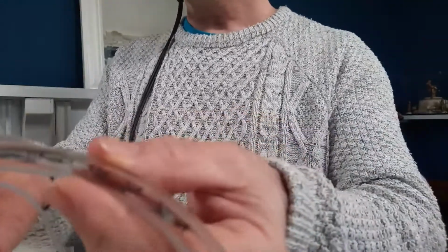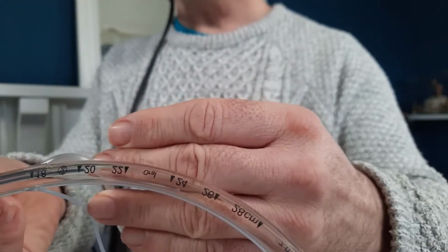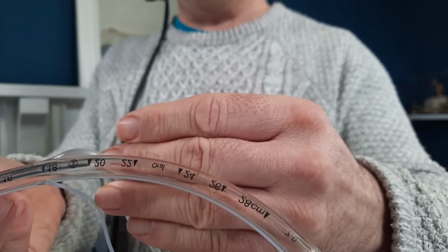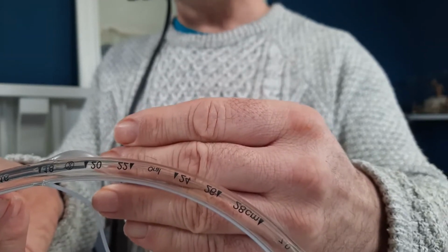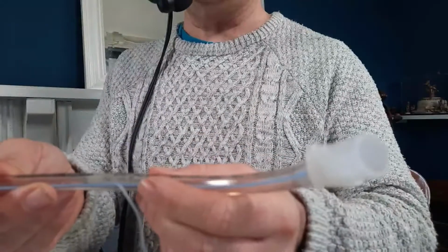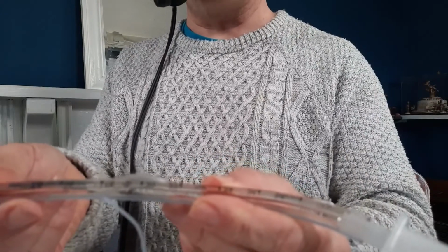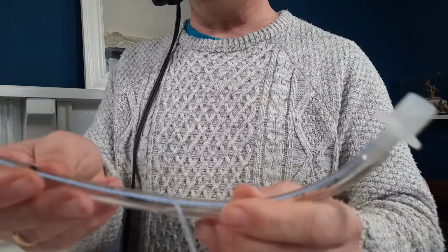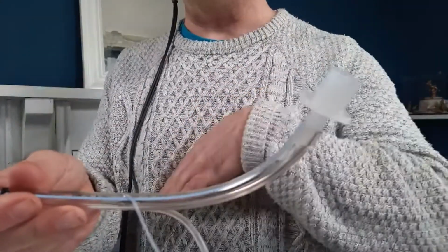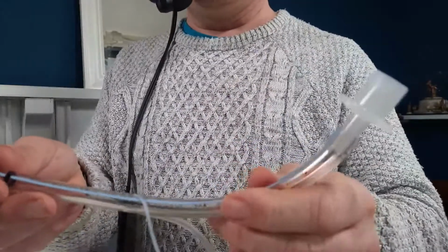So once you've put it in, and you can see those markings, there you go, that's nice and clear, isn't it? You will then mark that on your ITU chart, and you will know if that tube has moved. And something like 22, 24 at the teeth and lips is probably appropriate, because one thing you don't want to do is put it in so far that it actually goes down the right main bronchus and you're only ventilating one lung.